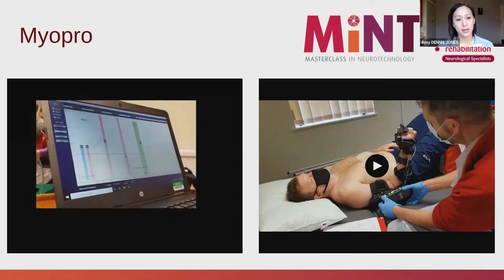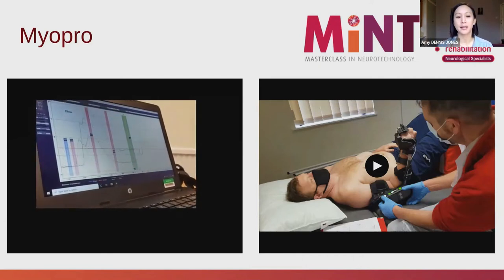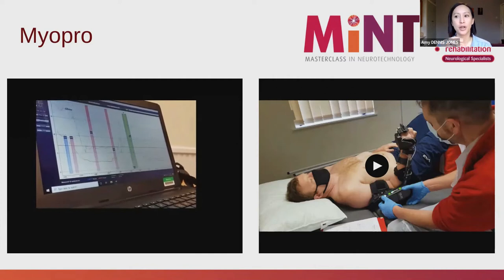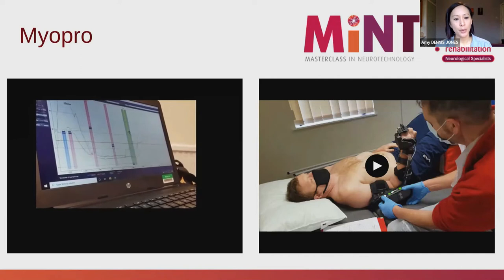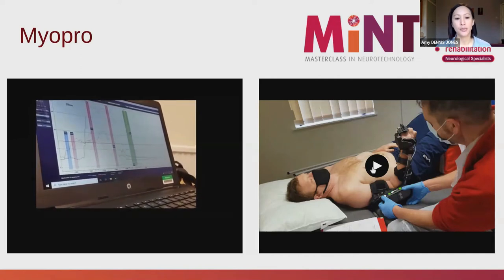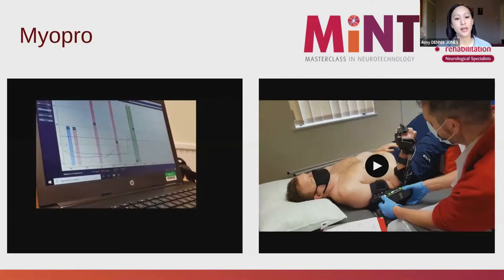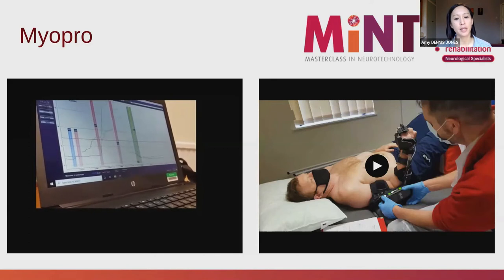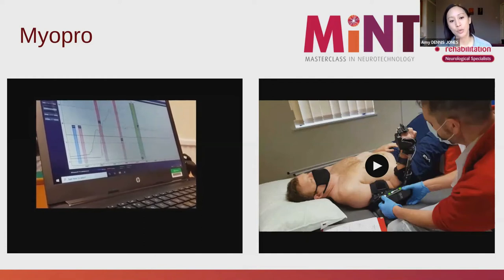And you can work on sustaining. So you can see here, he's trying to sustain right at the end. You can see lots of little peaks. He's trying to sustain his tricep activity whilst reducing his bicep activity towards the end. You'll see that in a minute in the next, as it comes up. So that's his triceps and trying to reduce his bicep activity. And then here we're trying to get him to sustain his tricep activity, the top line, while also trying to reduce his bicep activity.